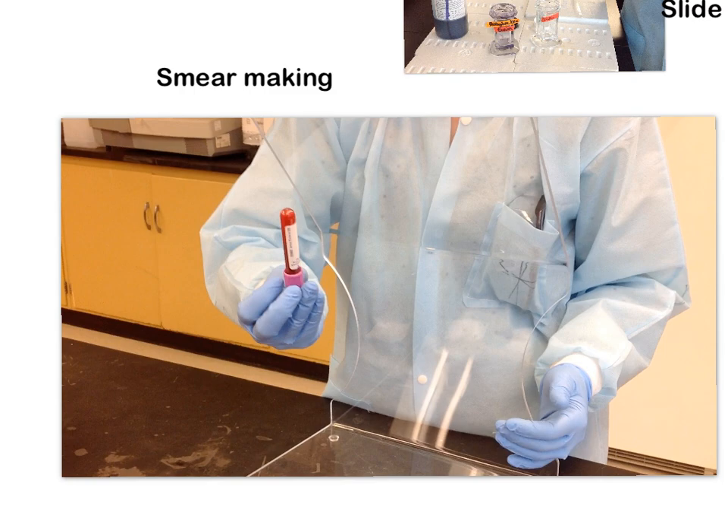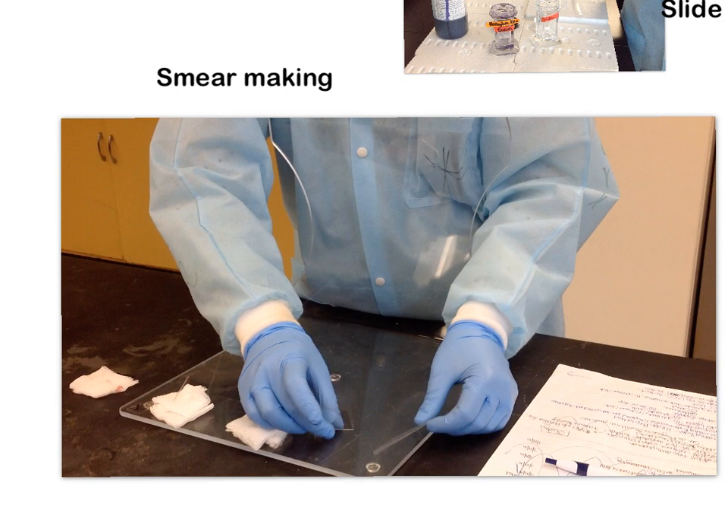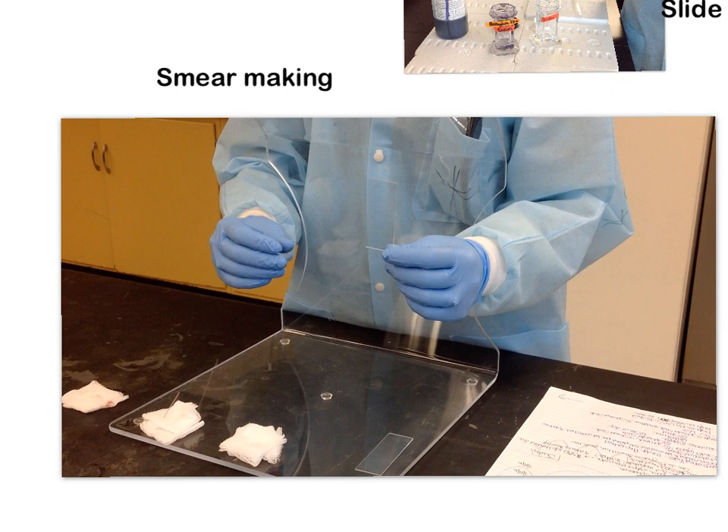The very first thing that you need is the equipment to actually make your slides. You're going to have a nice tube of well-mixed blood that's already on the mixer for you. You'll also need two slides: one we're going to call our specimen or smear slide, and the other we're going to call our spreader slide.